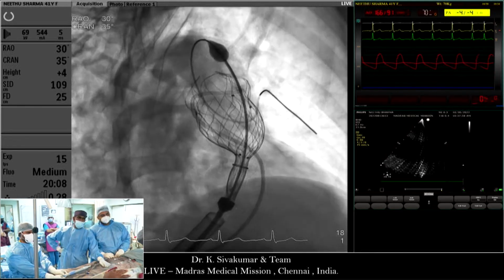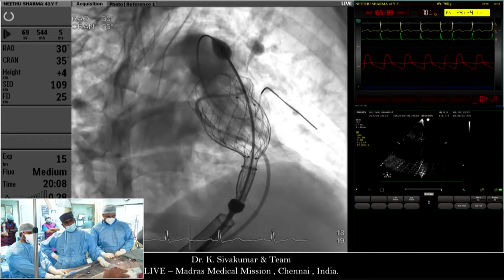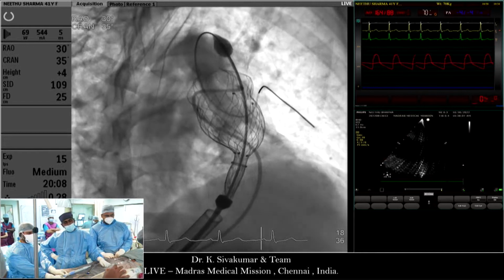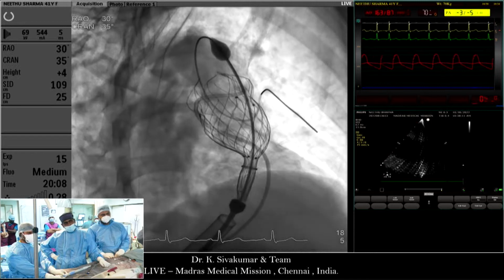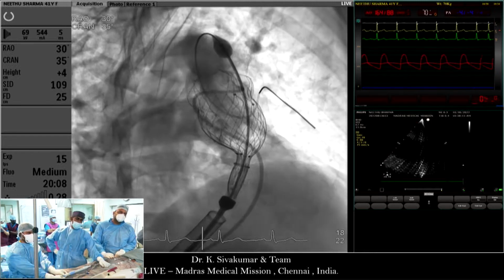You see that the inner portion of my annulus is in line with the marker. Actually, the proximal gold markers are aligned with the annulus now. So the valve is getting restrained towards the RV inflow. The moment you open out, it will spring back into the natural alignment.